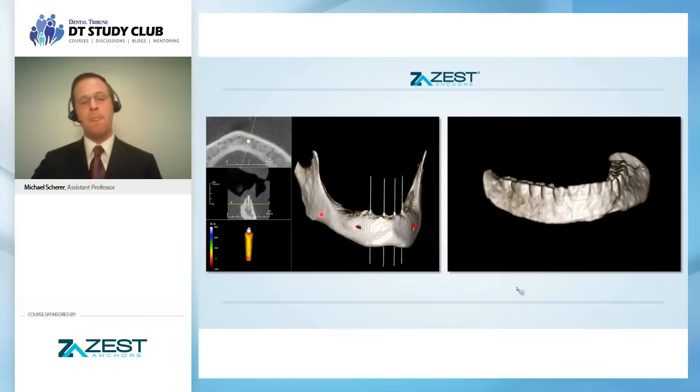And what we like to do when we treatment plan cases is use soft tissue separation here. What you're looking at is not a barium duplicate of that patient's denture. All we're doing is taking the tongue position, the cheek position, and the lips, and separating them. So it's more or less, watch me for a second, just going like this and creating an air pocket around the complete denture.